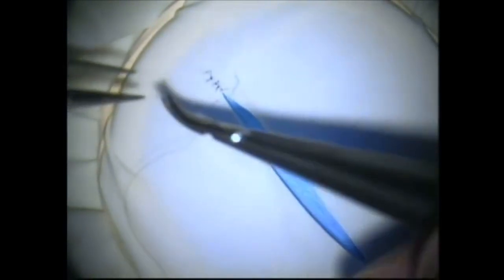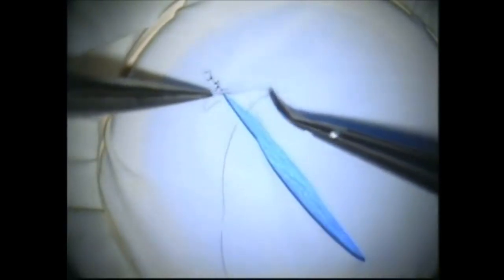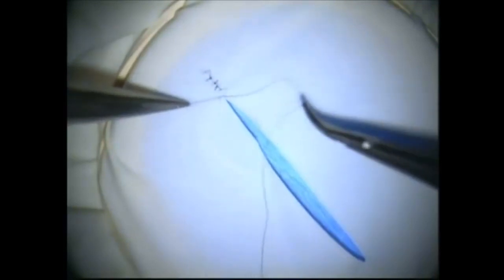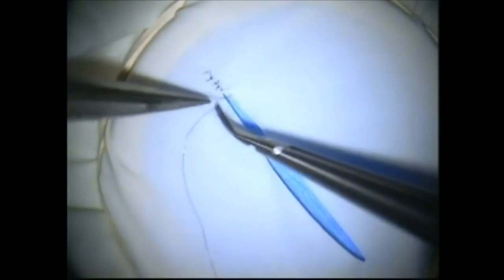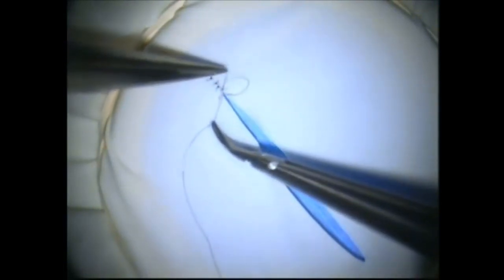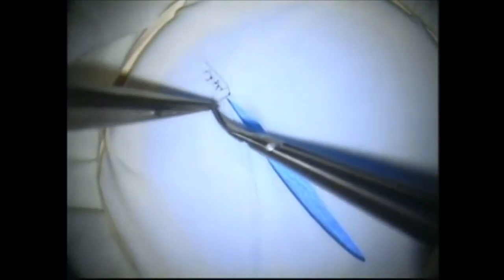So what we do is turn the right hand palm up, grasp the end of the suture, make the loop, pass it, make our first throw, do not let go of the right hand, make the second loop — and notice how easy it is to pick it up using the left hand. We use our technique to tighten the edges down, and finally a third throw completes it.